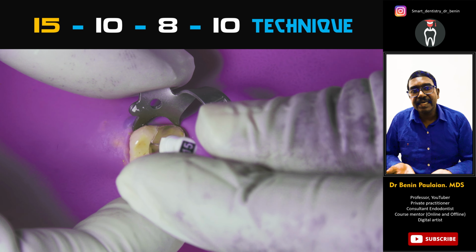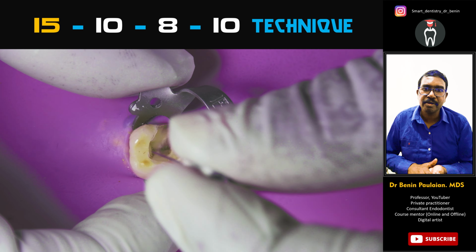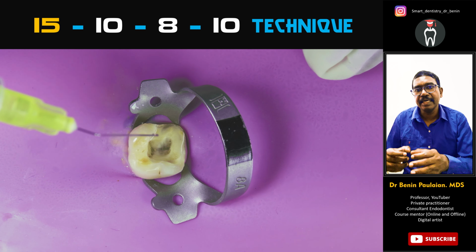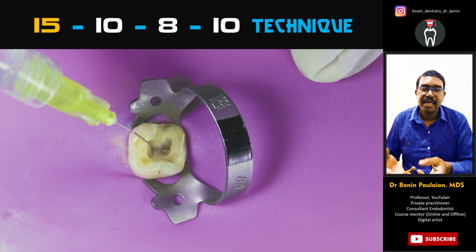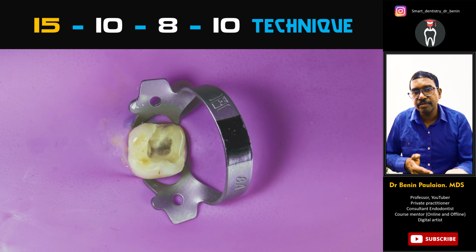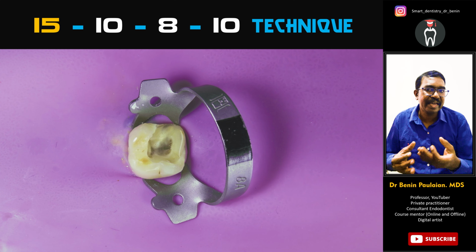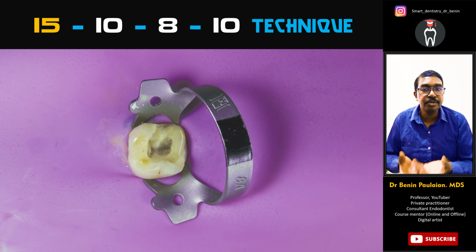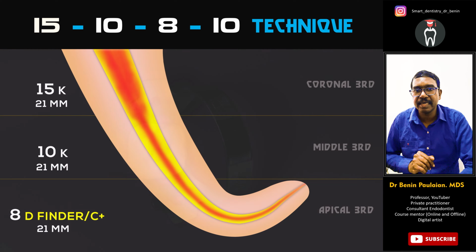Okay, so the use of having the sodium hypochlorite in the pulp chamber is, whenever the file comes out or goes inside, it will remove the calcifications and they will get dissolved, or the debris will be removed in the sodium hypochlorite. So you need not wipe each and every time while doing canal negotiations, and there are no chances that these calcifications or the solid masses will go and block the canals too.